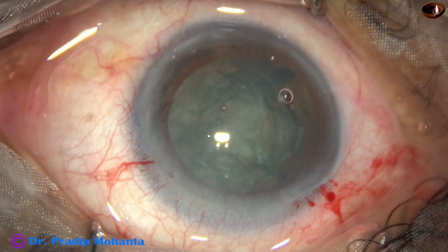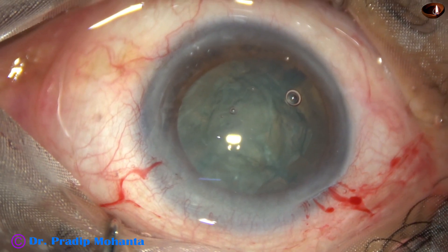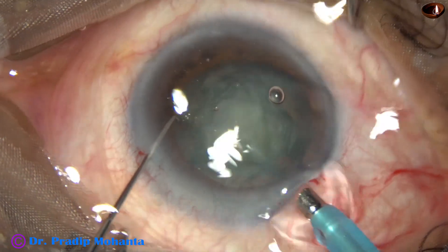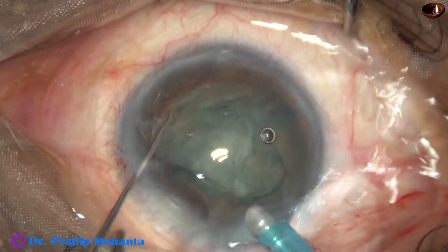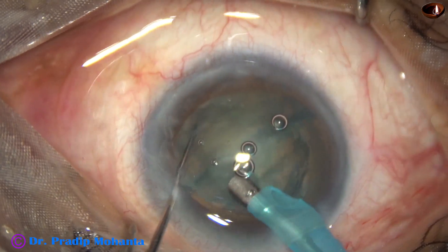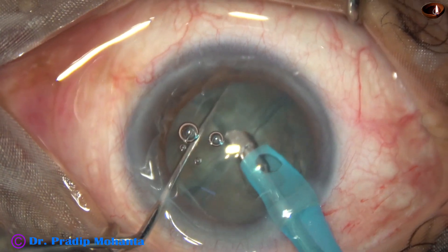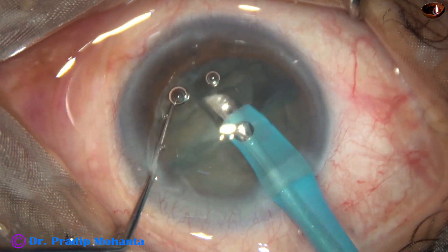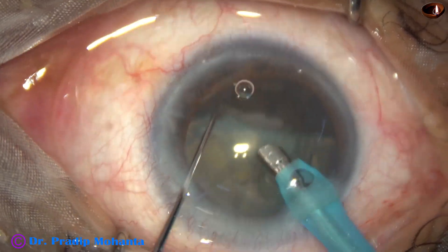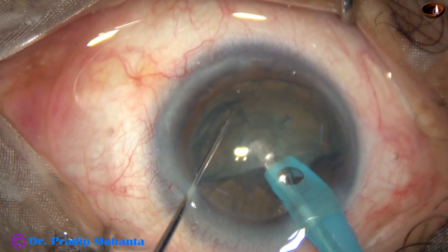The phaco handpiece goes into the anterior chamber. The phaco needle is introduced with its bevel down towards the lens mass. Some superficial lens matter is removed, then the handpiece is turned slightly so the bevel is sideways, and one piece is picked up and emulsified.